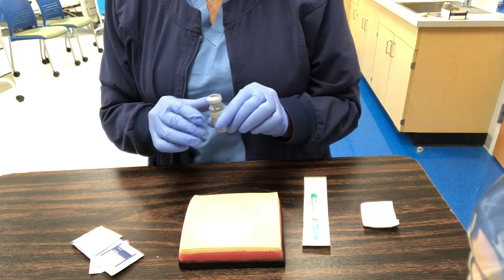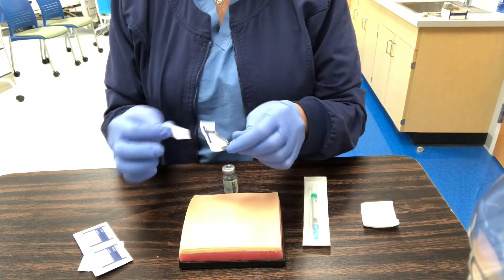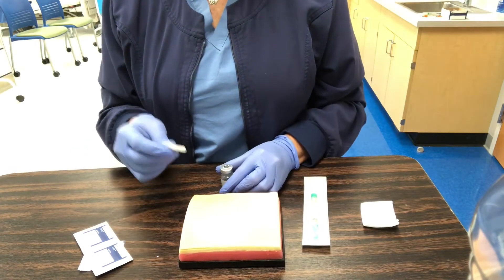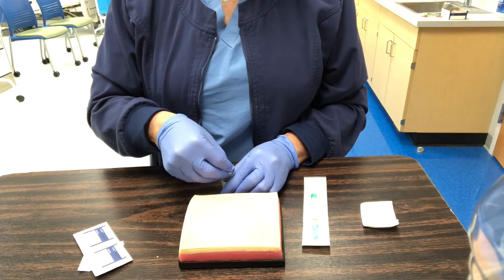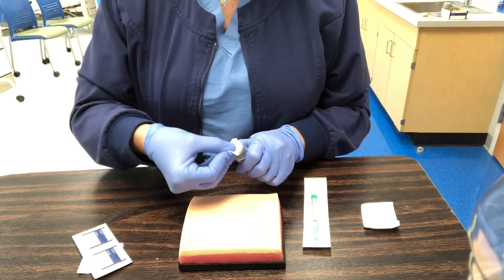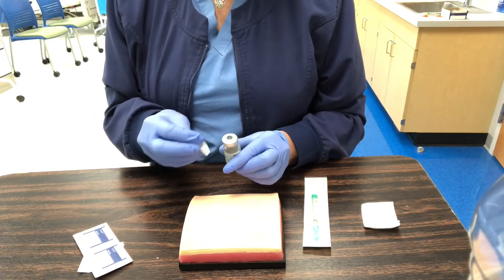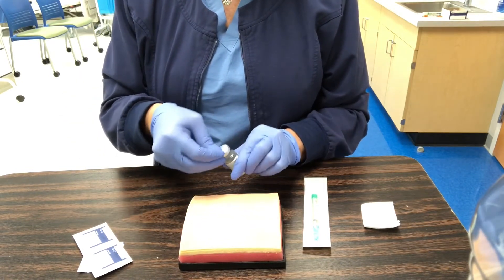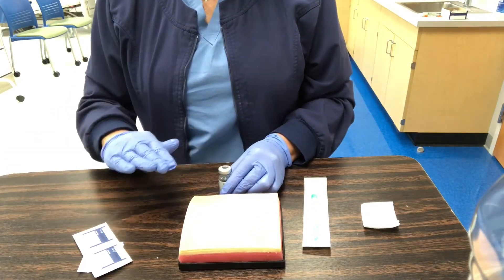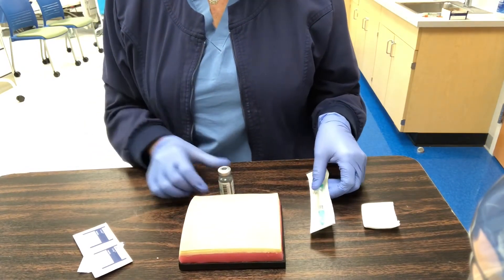I have a vial — it's a multi-use vial. Evidence-based practice has proven that we swab the top of all vials, multi-use or brand new. So I'll use another alcohol wipe and start on that rubber stopper with my thumb in a circular cleansing motion. You don't have to clean the whole vial — just the rubber top area where the needle will go in, to make sure it's clean.